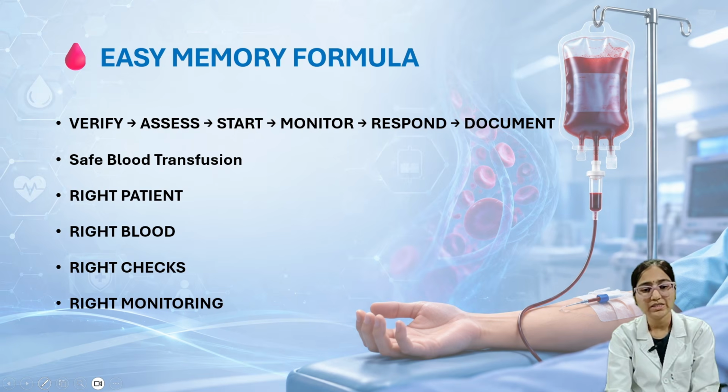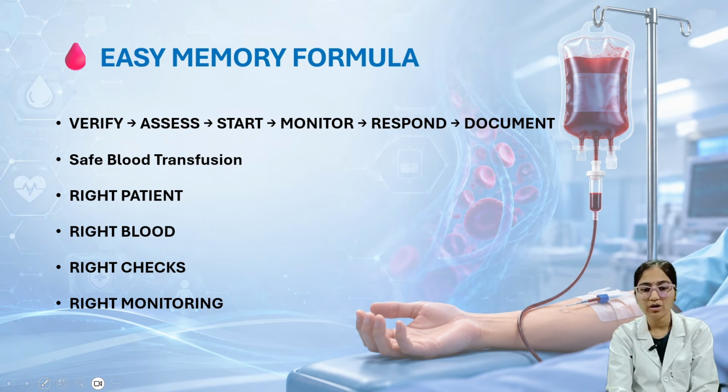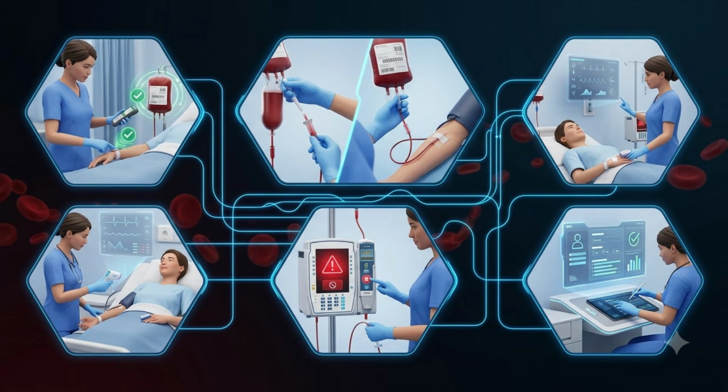Next, easy memory formula. Okay, we need to verify. After that, we need to assess. We need to start the procedure, monitor, respond, and then document. Your safe blood transfusion is by right patient, right blood, right checks, and then right monitoring.